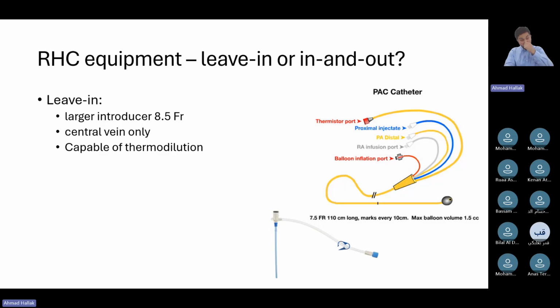We've also heard of instances where people had the PA catheter wedged in the very end of the PA artery, the most distal pulmonary artery, and it's wedged, so it's holding that artery, and when they pulled back, they've torn the pulmonary artery, and that patient didn't survive.